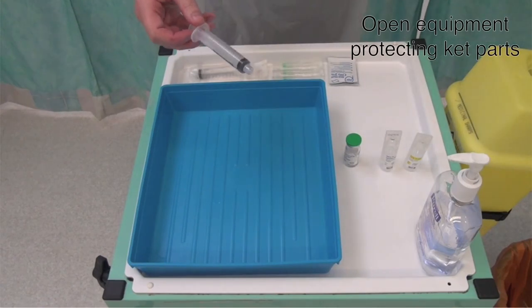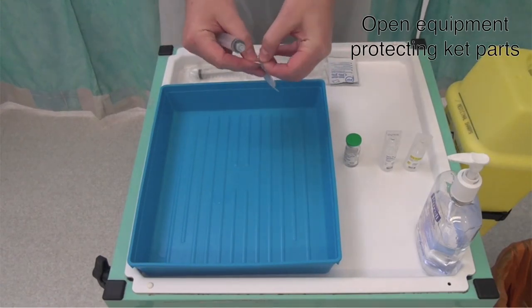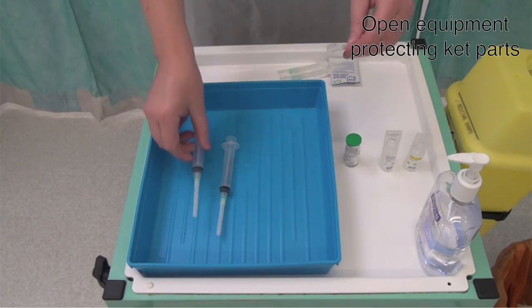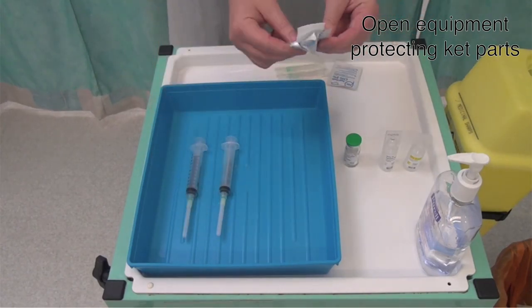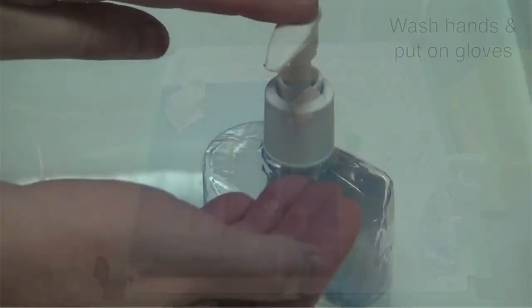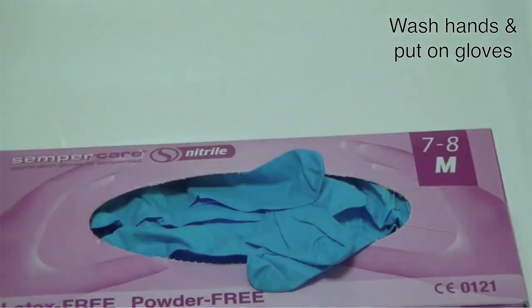Make sure the key parts of the needles and syringes are protected by attaching them together before placing them in the tray. Open the wipes ready for use. Wash your hands and put on a pair of gloves.